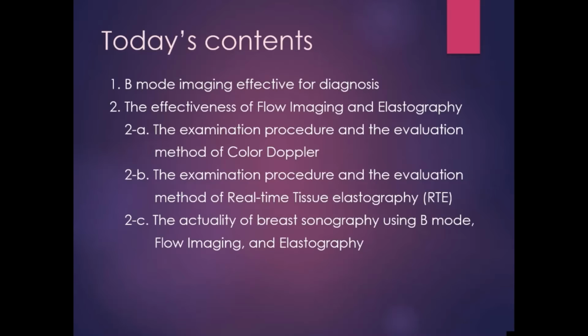Today, first, I'll explain B-mode imaging effective for diagnosis. Next, I'll explain the examination procedure and evaluation method of color Doppler and real-time tissue elastography. In the end, I'll show the actuality of breast sonography using B-mode, flow imaging, and elastography.